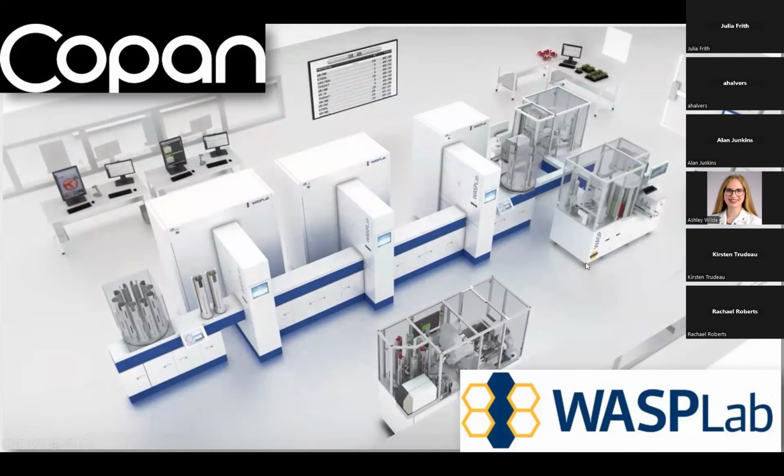This is the other one that's commonly available, the WASPLab. It is actually built by Copan, and has a few different distributors in the United States, but it's the same kind of process. Here's the plate streaker. The plates get streaked and go on the line. This conveyor belt brings them into one of these imaging units, which take photographs at time 0. Then the plate slides into one of these incubators and stays there for a certain amount of time.